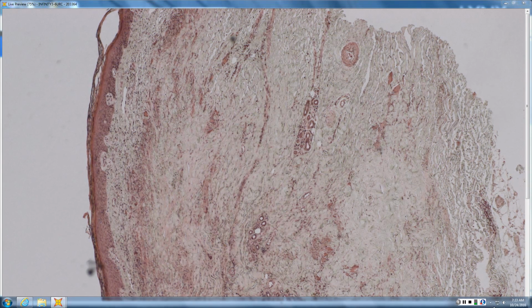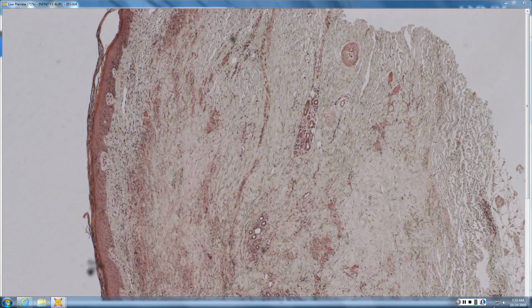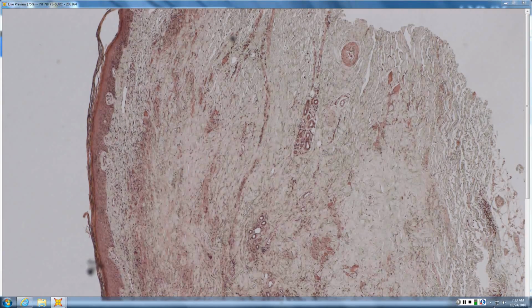Sort of make out like a palisading portion there. Imagine that in this chapter, palisading granuloma. First off, the slide looks kind of washed out, right? Is the epidermis super washed out, or is the epidermis kind of okay? Okay, so it's not just a bad stain, it's that the dermis really is washed out looking, which is part of the pathology that you see here.